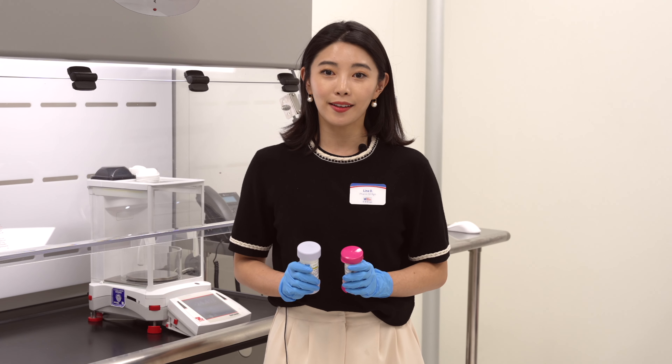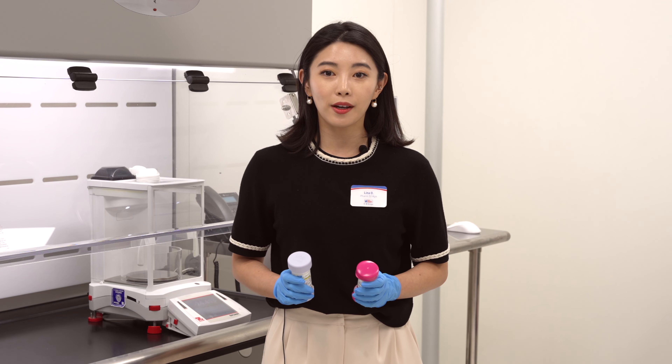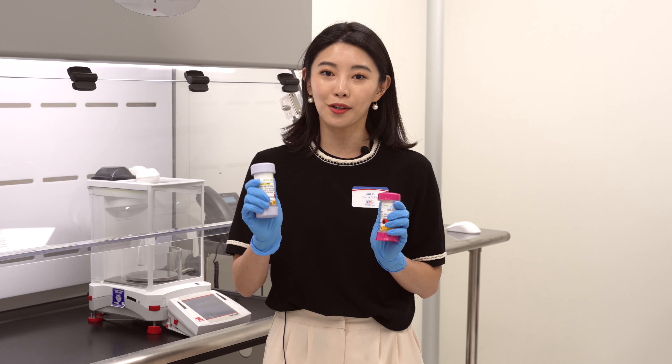Hello everyone, my name is Lina, your compounding pharmacist at HB Pharmacy. Today we're going to be going over how to use your TopiClick or your Uno dose.